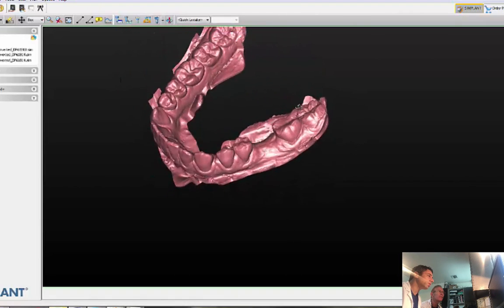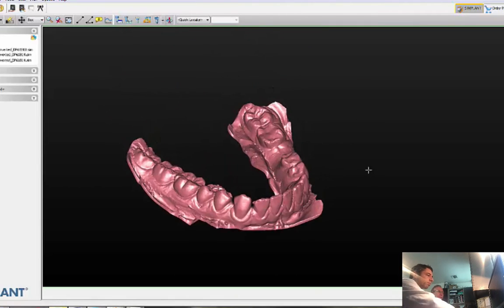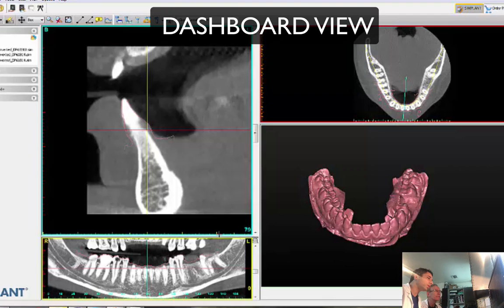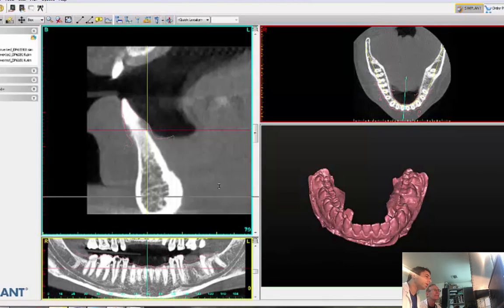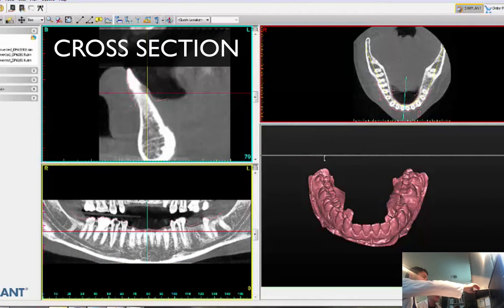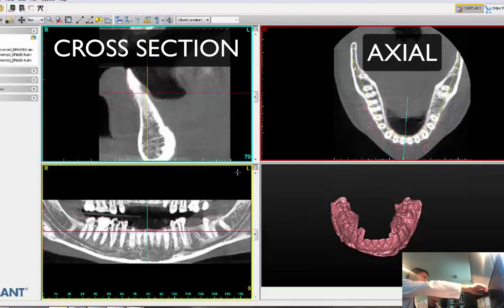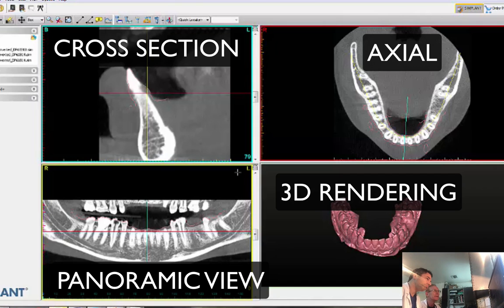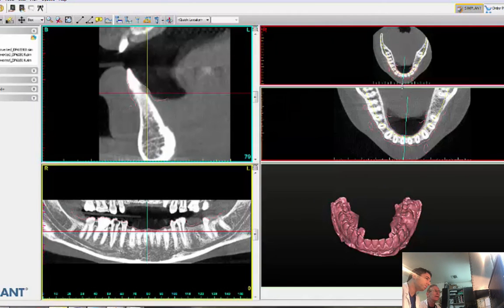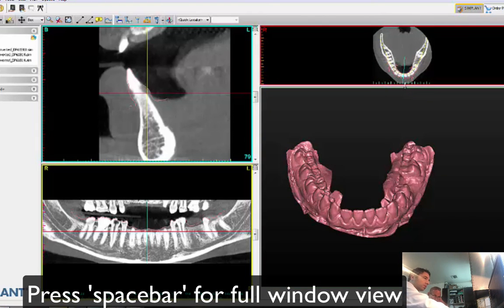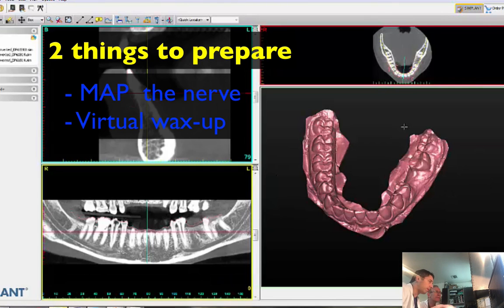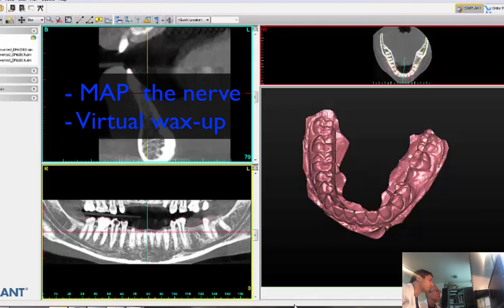A couple of things you want to do when you prepare. The software has what I'll call the dashboard window, which has four parts: the cross-section, axial, panoramic view, and 3D rendering. You can minimize or maximize as much as you want. If you press the spacebar, you can focus on that view. When you plan a lower molar, there are two things you need to do. Number one, you need to map the nerve. You can see what it says — preparation for planning.